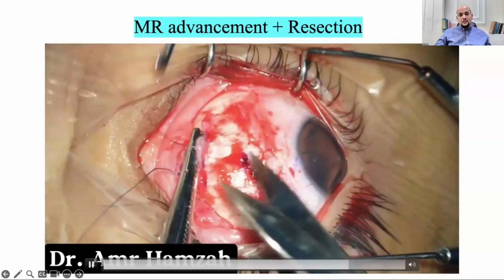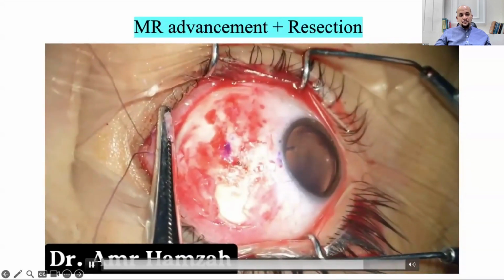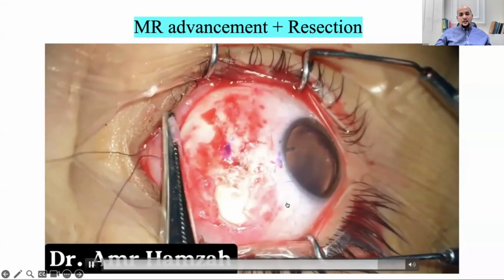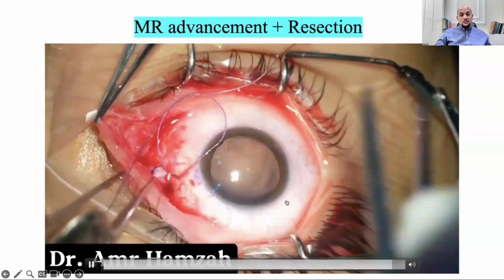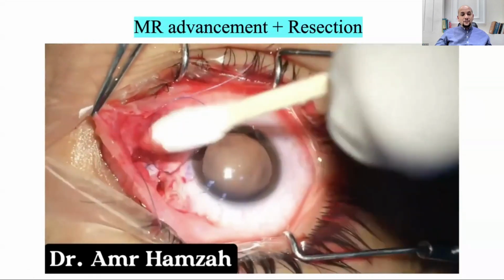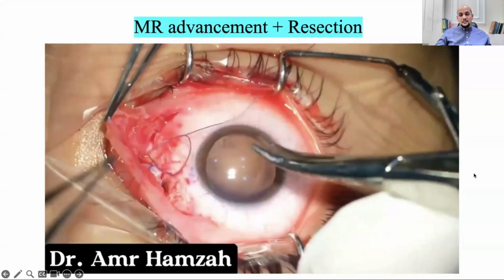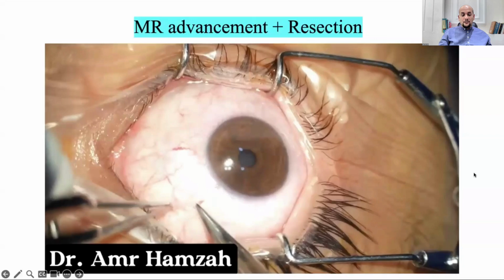After doing the resection, I measured 5.5 millimeters from the limbus, the original insertion of the medial rectus muscle, and I attached the muscle to the sclera and closed the conjunctiva. And again, in resurgery cases, closing the conjunctiva is usually not an easy thing.